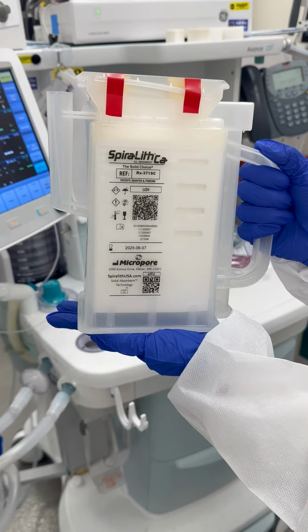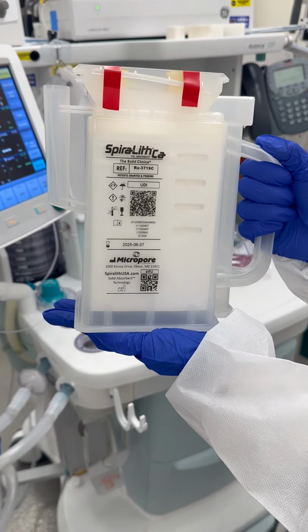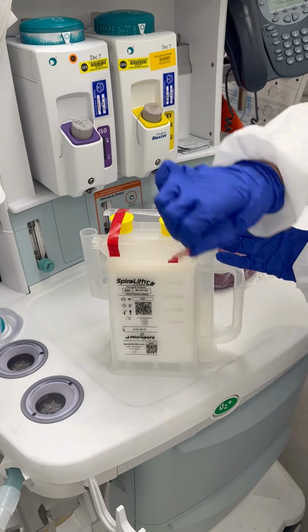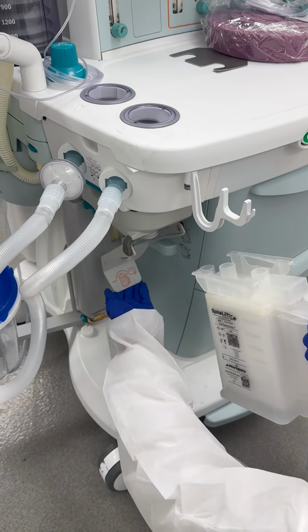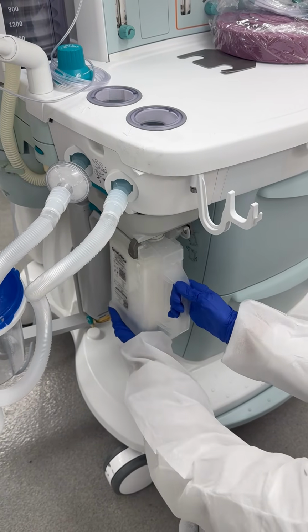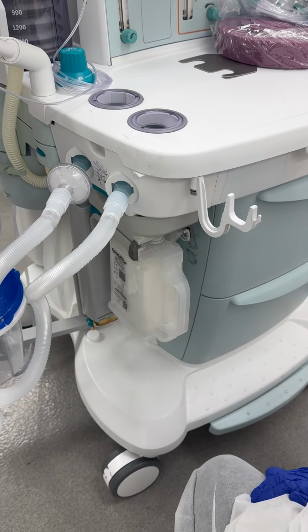One thing to note is that UV light exposure will reduce the indicator color change, so consider storing cartridges away from light exposure. Prior to loading the canister, remove the tape and end caps. Then load the canister. Slide the canister all the way to the bottom stop of the holder. Then push the canister up into place from the bottom of the canister until the latch engages.